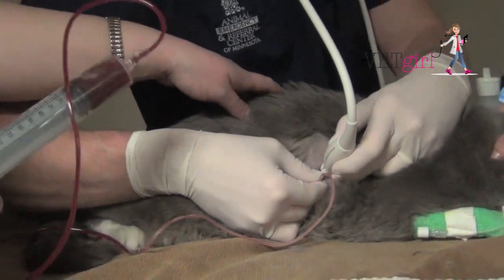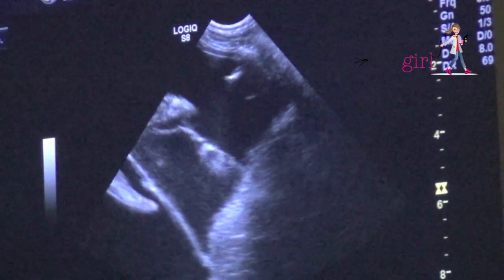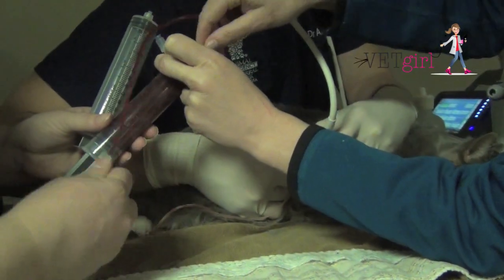On repeat FAST, you can see there's still a significant amount of pleural effusion. Here, we're actually saving the pleural effusion because it was quite hemorrhagic, storing it in sterile 60 mL syringes in the event that we need to autotransfuse it.